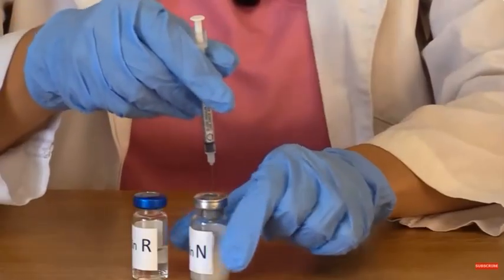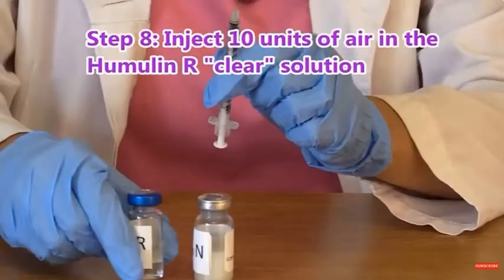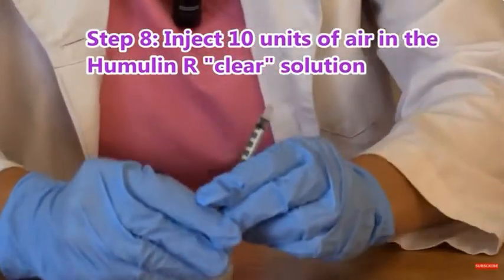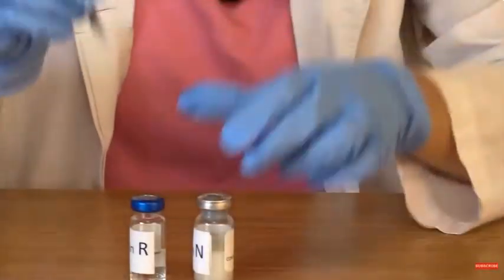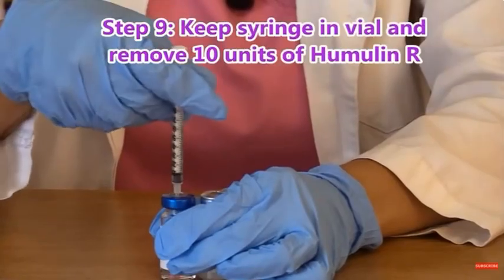Then we're going to remove our syringe and inject 10 units of air into the Humulin R. So we're going to pull back on the plunger to 10 units and do the same thing, but we're not going to remove our syringe.